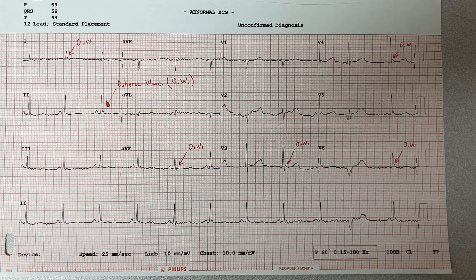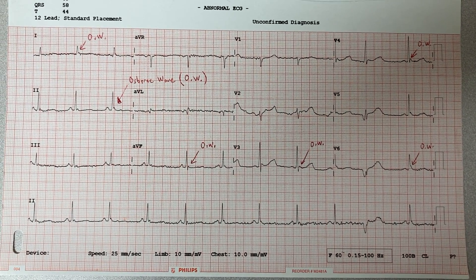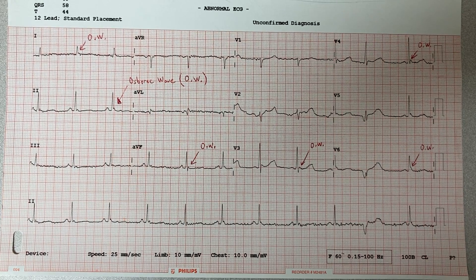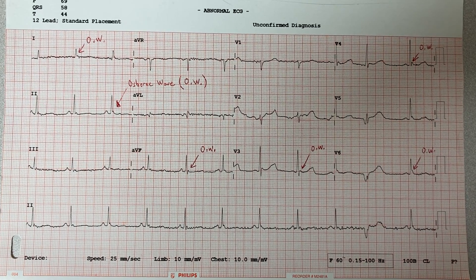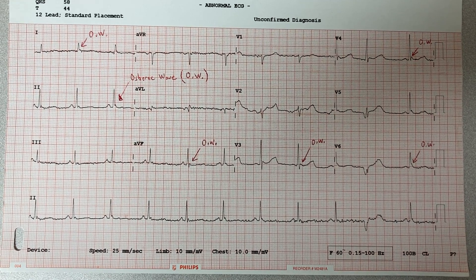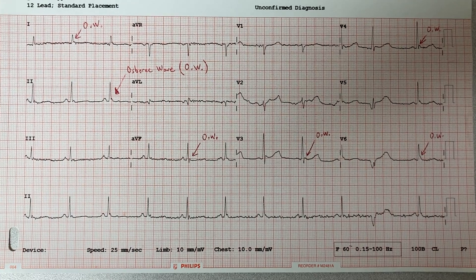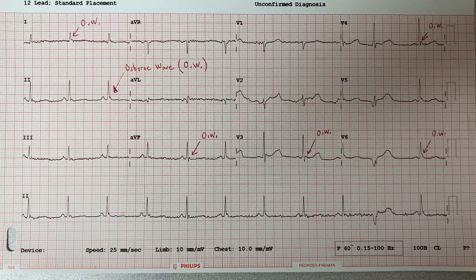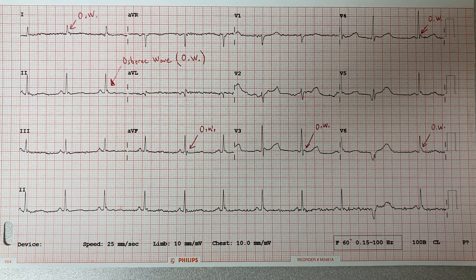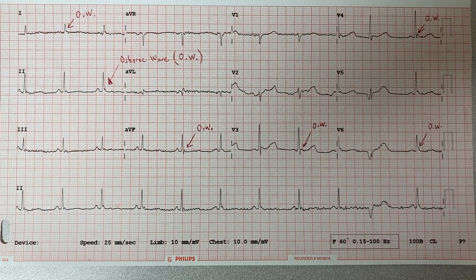As you can see, he's got clear J waves, or as they were first described by Dr. John Osborne back in 1951, Osborne waves immediately on the downstroke of the QRS.